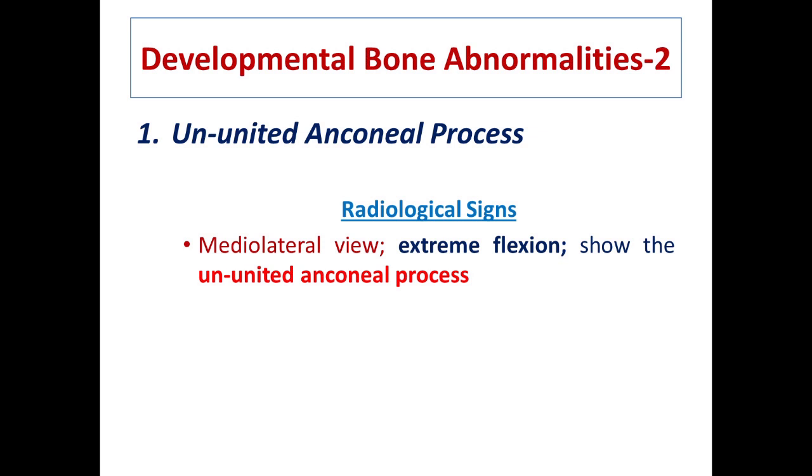It means that you put the animal in lateral recumbency of the affected side. The primary beam of the X-ray enters from the medial side and exits from the lateral side that is in contact with the X-ray cassette. So this will be called a mediolateral view.